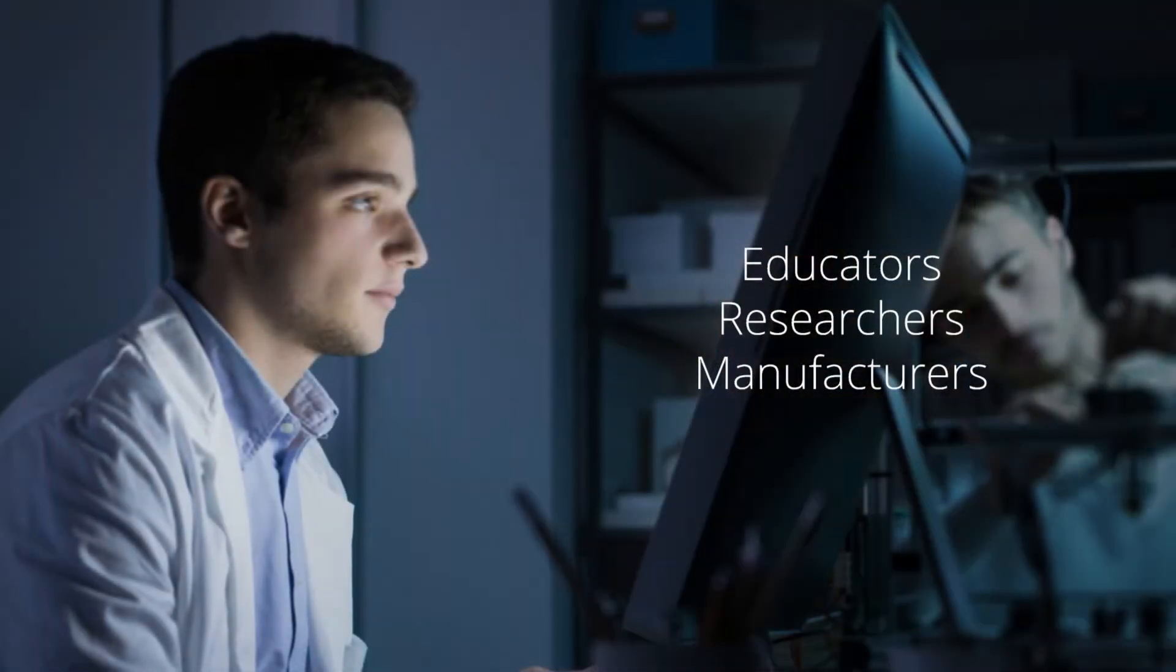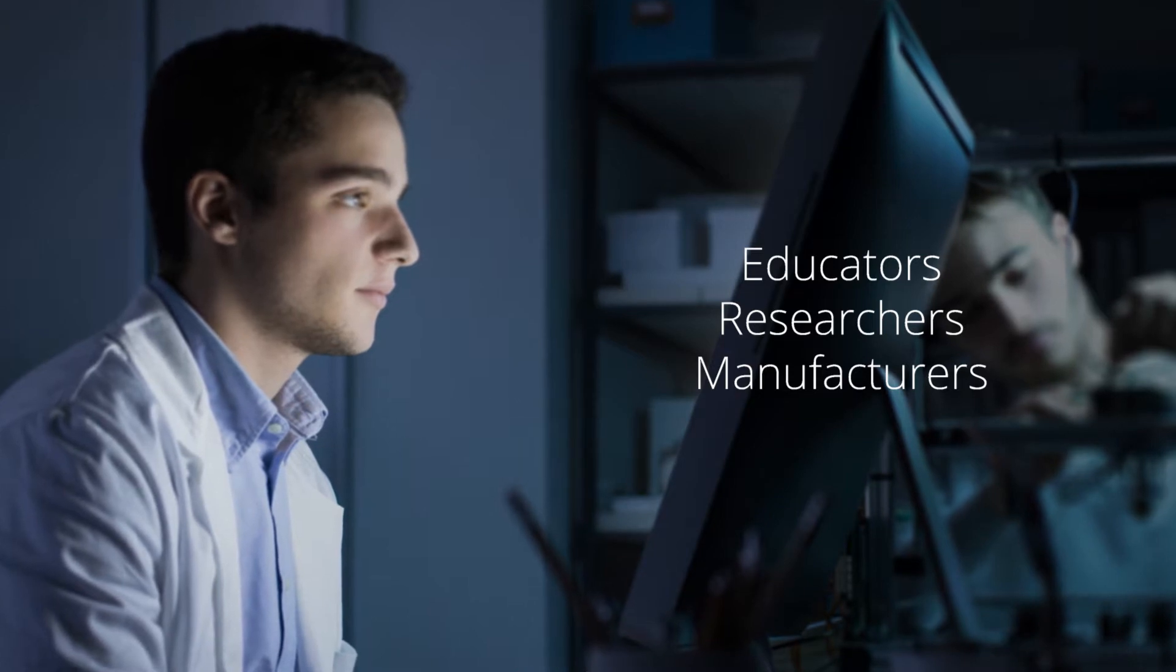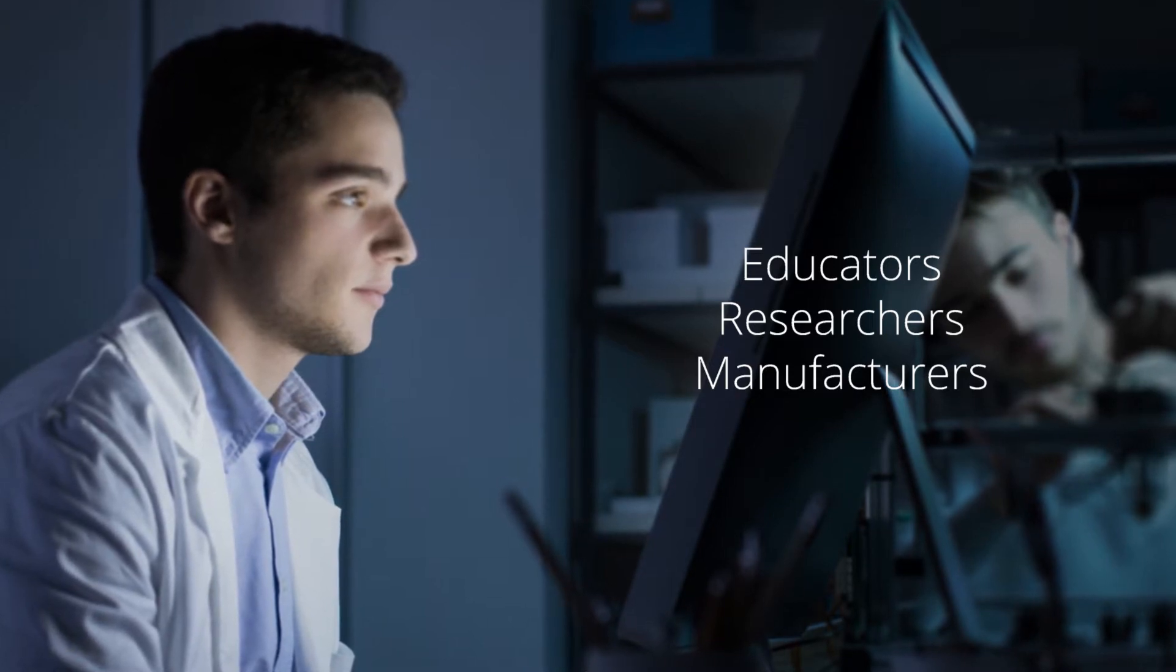Now, Lumetica's low-cost OCT system is opening the doors for university educators, life science researchers, and even manufacturers in industry to see how this important technology can help them with their imaging tasks.